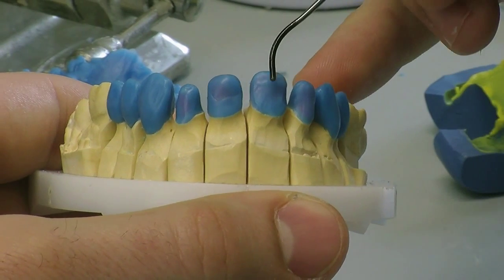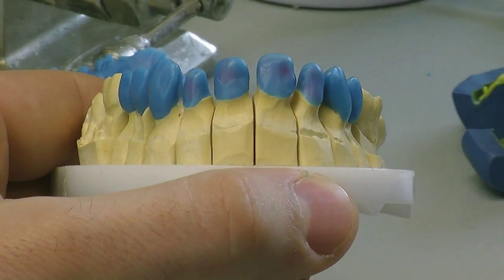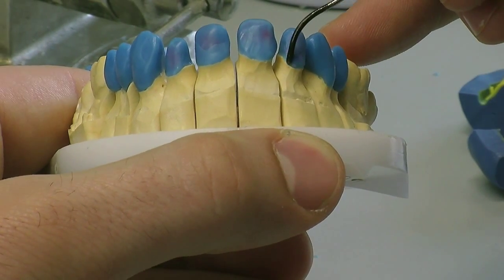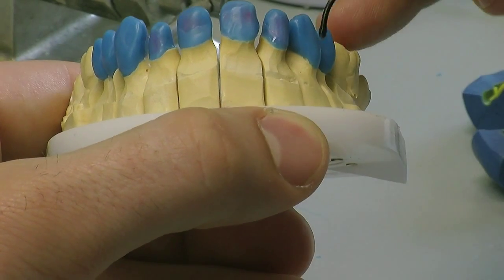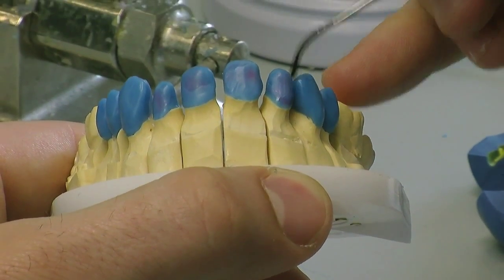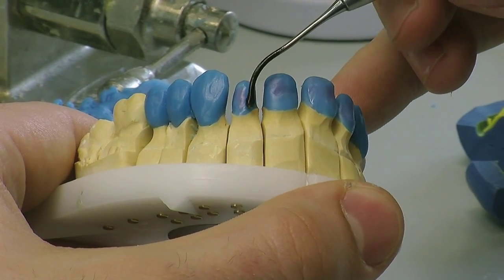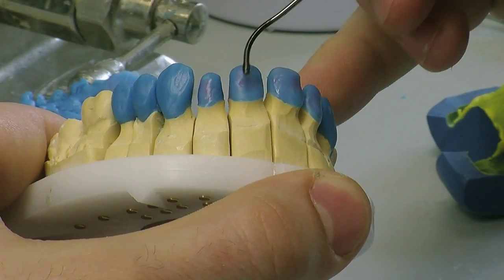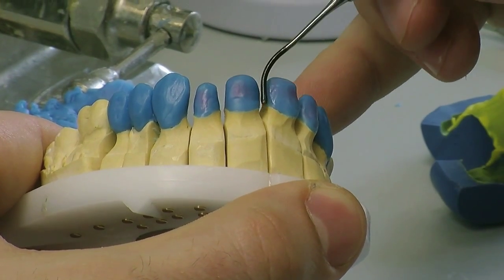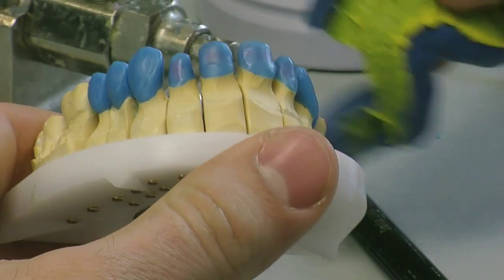The case has been brought into the lab and we've made our models, we've articulated them, we've used the LuxorBite bites provided by the dentist — extremely accurate, cut down, trimmed and skimmed. We've then mounted this up on our articulator, we've done our copings on the anterior section and we've already waxed up our posterior section as to the trial smile model, which is taken when the temporaries have been finalised.